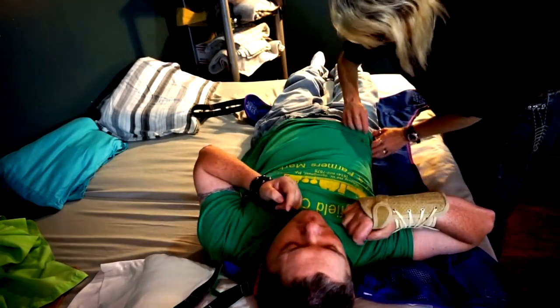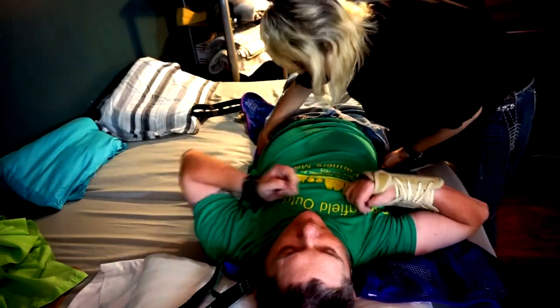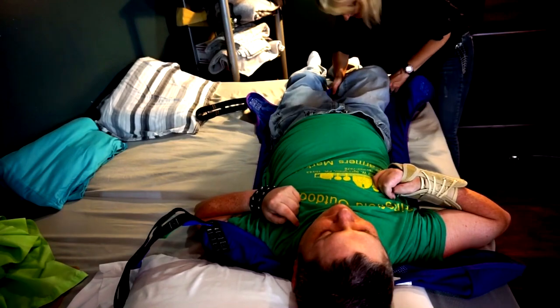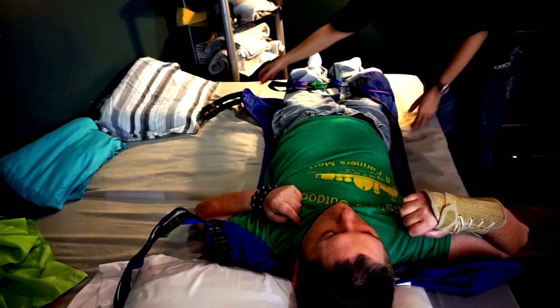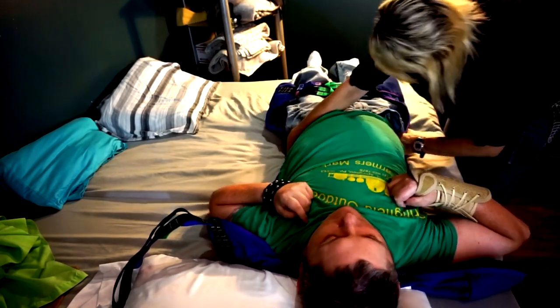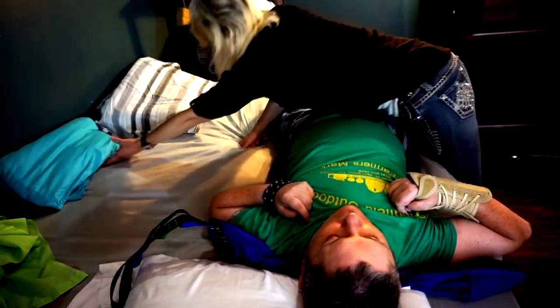I roll back flat and I try to center myself as close to the center as I can so my weight is right in the center of that sling. You don't want to be too far to one side or the other. I give it a couple tugs, make sure everything's lined up just right, and I try to tug the jeans enough so there's not a snug crotch — nobody likes a snug crotch.